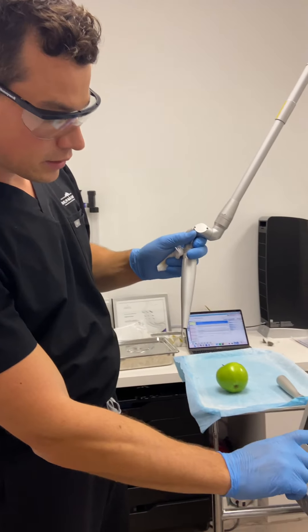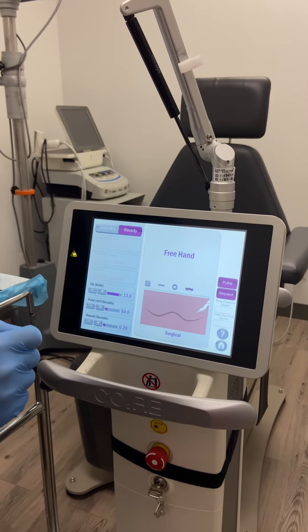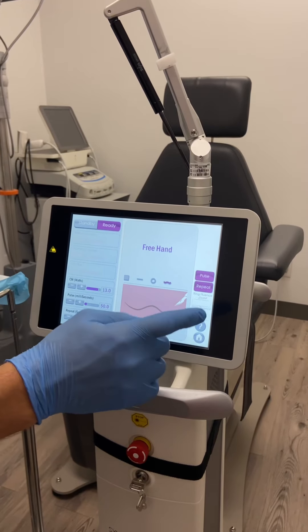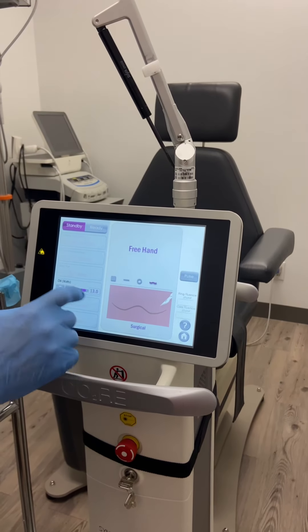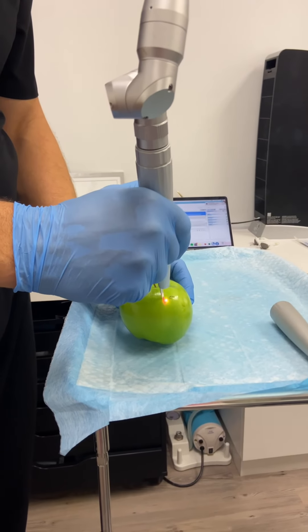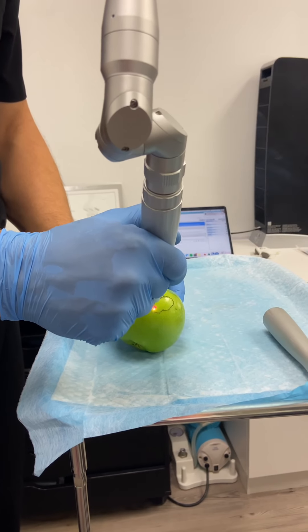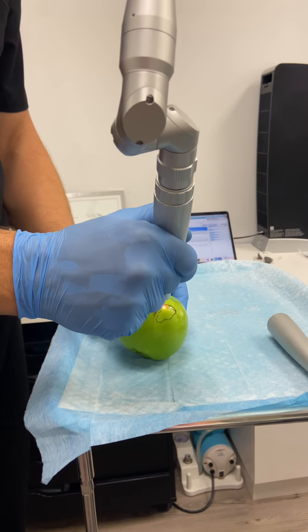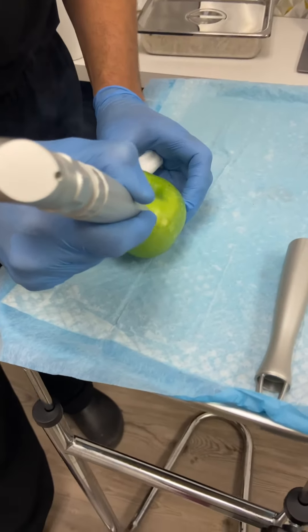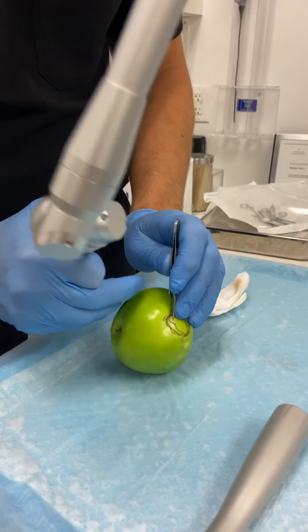Now I'm going to show you what this can do on surgical mode. I've switched the mode over and I go freehand. This would be something I'd use to remove a keloid. The advantage of using this is that there's no bleeding because it cauterizes as it cuts, and it's also atraumatic. I'm going to set the energy all the way up without a pulse, and I'm going to cut the apple with this. You can go around a mole, you can go around a keloid, and some people use this for blepharoplasty surgery — I'm literally cutting right into this.